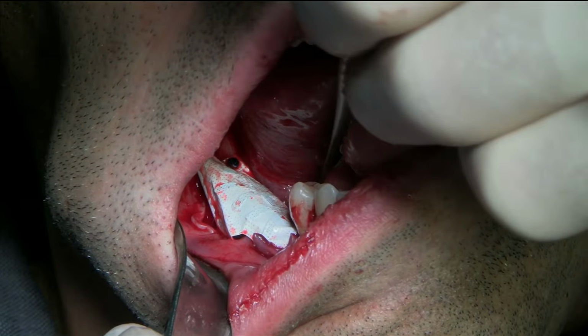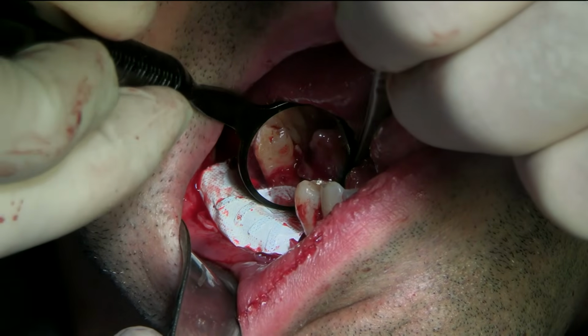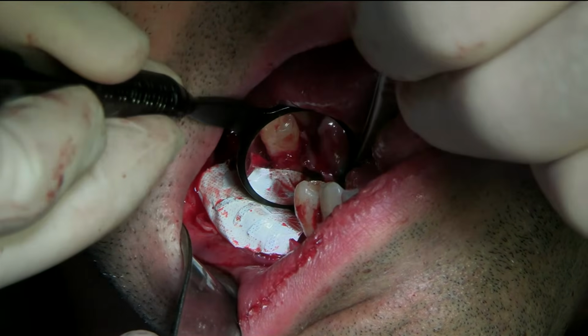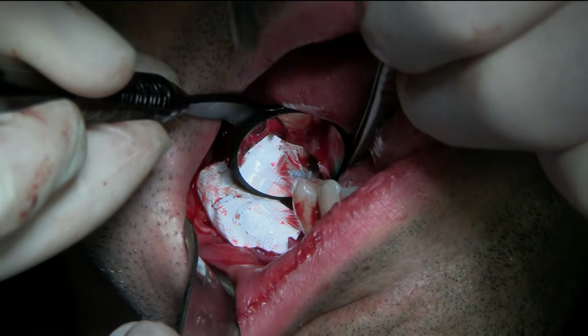Double check again. Yeah. Okay, it's right there. I don't know if you can see it. There. Okay, there you go.